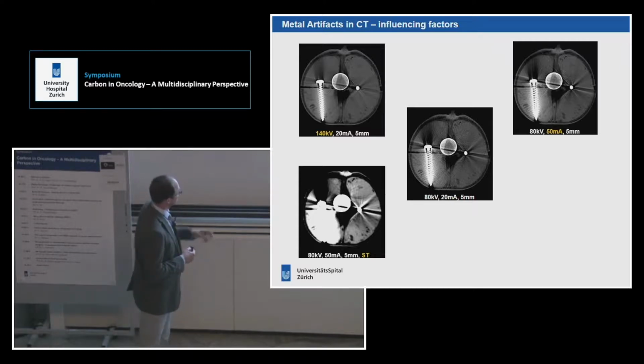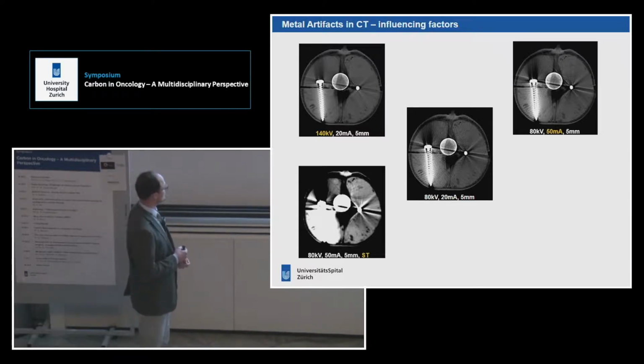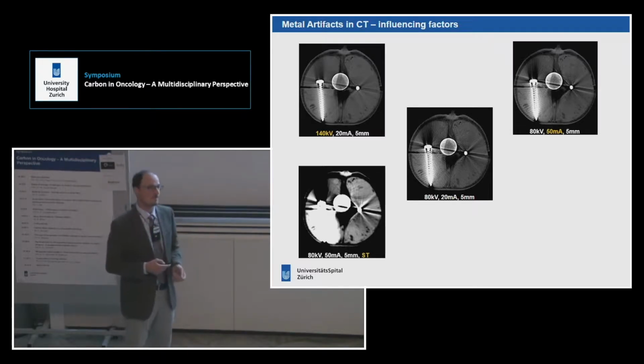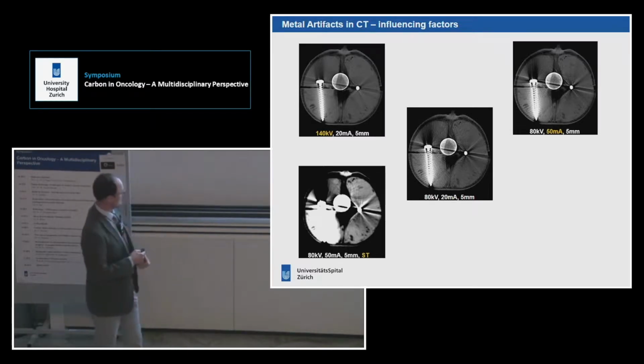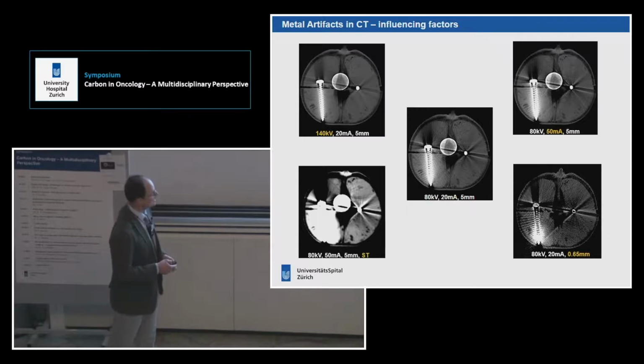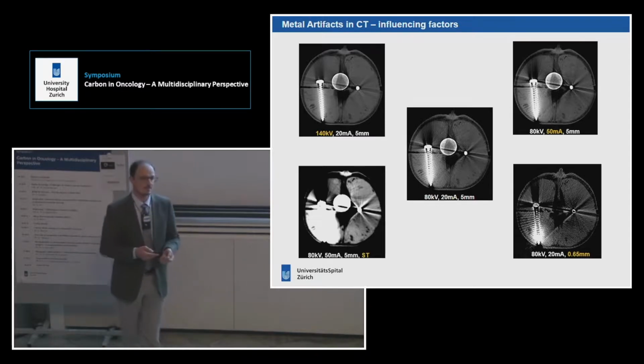If we change the window settings of the images that we look at and we use soft tissue reconstructions, you can see that we have a nice delineation of the orange flesh itself. However, we get a very smeared image appearance with very strong artifacts in the image itself. And then we can also play with the slice thickness that we look at. If you take small image slices, we have far more image noise in the images than when compared to a standard 3 or 5 millimeter reconstruction.